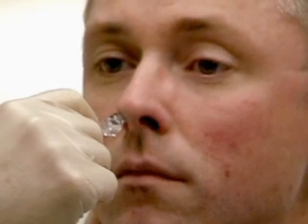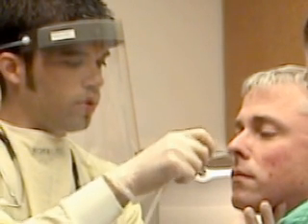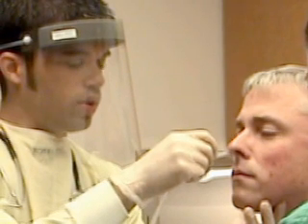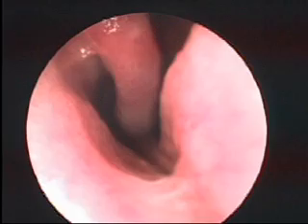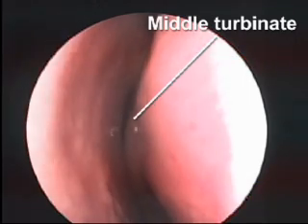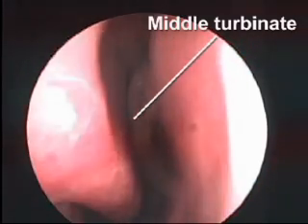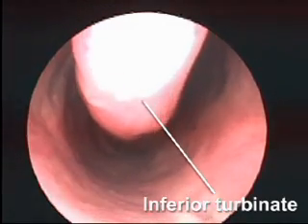Insert the tip of the nasogastric tube into the nasal cavity and slowly advance it posteriorly parallel to the floor of the nasal canal. The tube should not be directed upwards. In this endoscopic view of the nasal cavity, note that if the tube is passed in an upwards fashion, it will reach a blind recess at the middle turbinate. When the tube is passed parallel to the nasal floor, it reaches the posterior nasopharynx without difficulty.